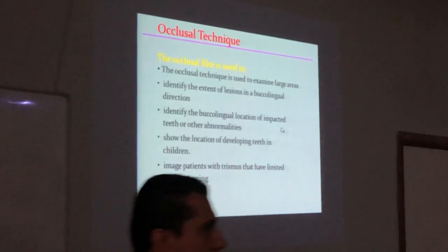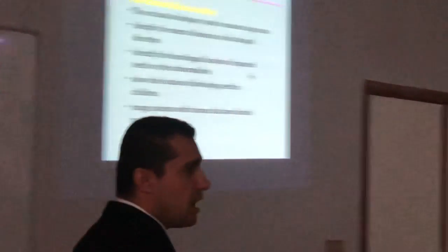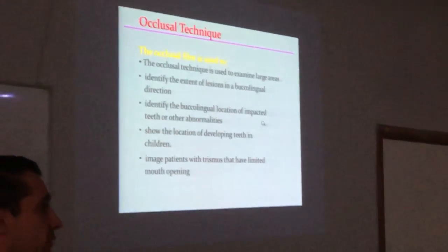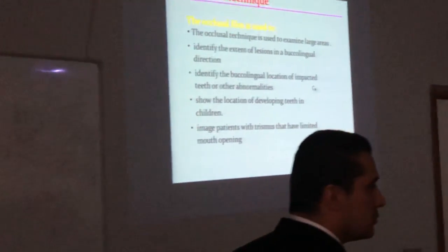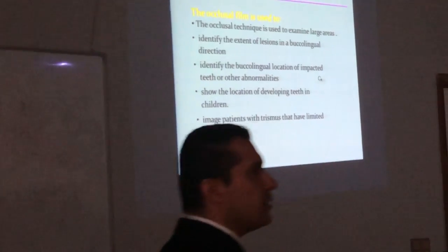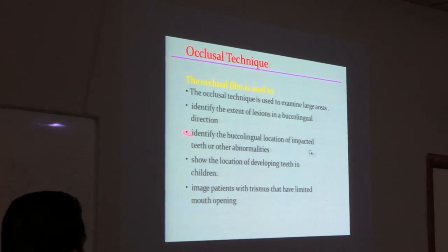Occlusal technique is used to examine a large area. If you want to examine a large area, the occlusal film will be used. Nowadays, it's not so used because we have OPGs. OPG will reveal more than occlusal, but it can be used in certain cases.